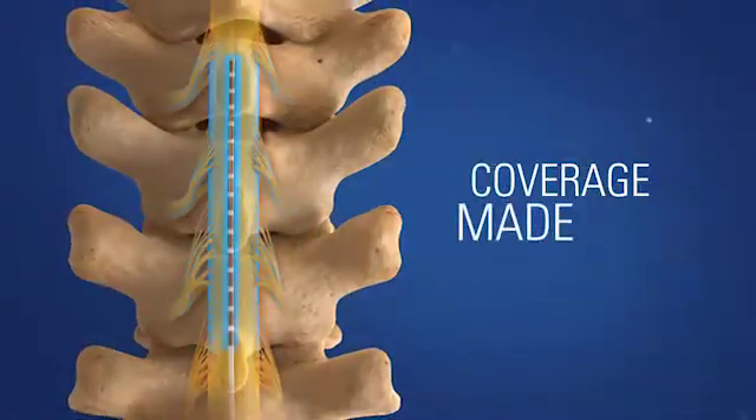From Boston Scientific. Coverage made easy.